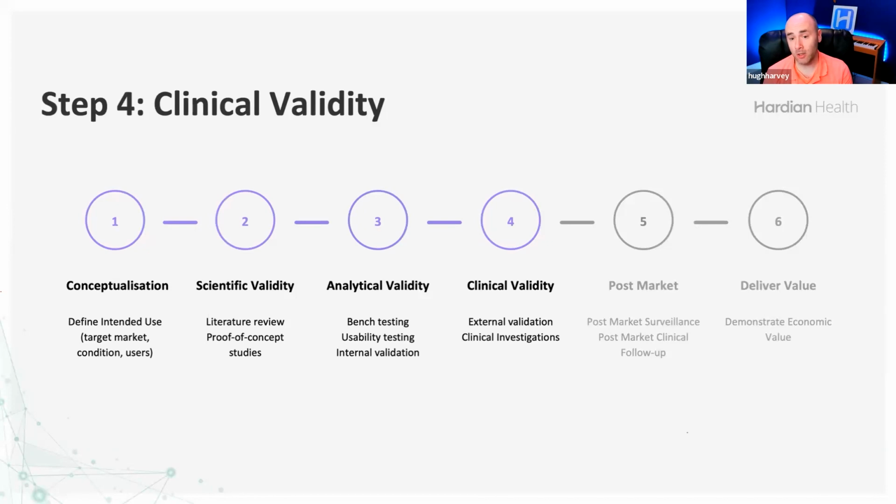It's also important to note that at this point, when you're going for clinical validity and you're running a clinical investigation of a medical device, you may need to apply for ethical approval and apply and register that investigation with the MHRA. And the MHRA will only approve that if you can show them you have done the scientific validity and analytical validity steps, and you have a documented software development lifecycle.